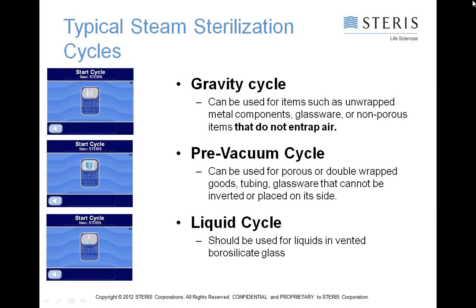So what is sterility assurance? It's a way of evaluating or monitoring the sterilization of various products to ensure that all pathogens or disease-causing microbes have been removed or destroyed, and to provide protection from recontamination. BIs and CIs are used as a supplement to physical monitoring.